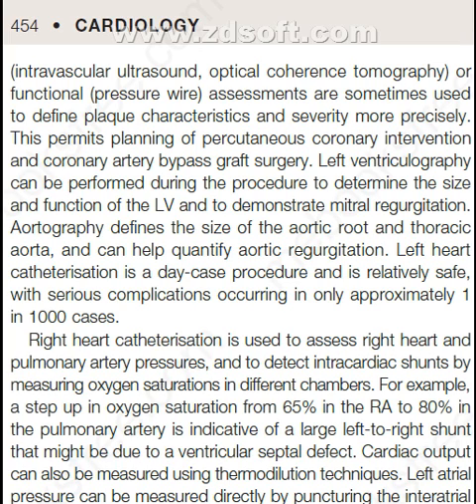Left ventriculography can be performed during the procedure to determine the size and function of the LV and to demonstrate mitral regurgitation. Aortography defines the size of the aortic root and thoracic aorta and can help quantify aortic regurgitation. Left heart catheterization is a day case procedure and is relatively safe, with serious complications occurring in only approximately 1 in 1,000 cases.